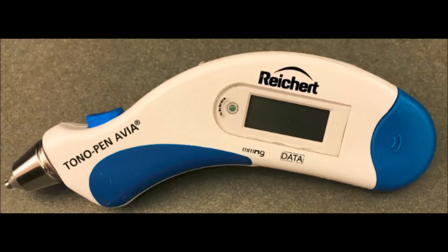In this video, we will demonstrate how to use a tonal pen to measure intraocular pressure.